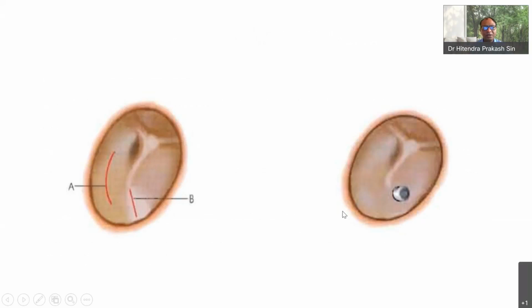Okay, these are the photographs depicting the incision placed on the tympanic membrane. As you see, this is the whole of the... Okay, let me just turn on the pointer.